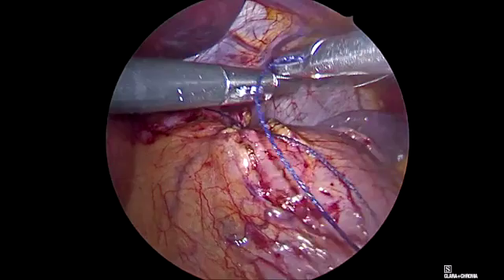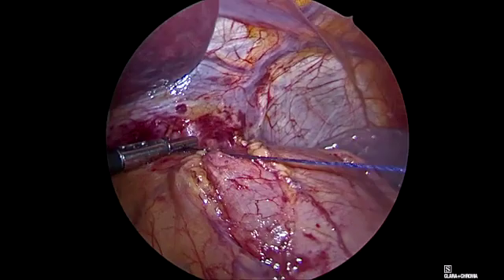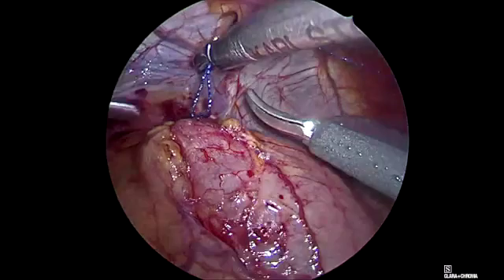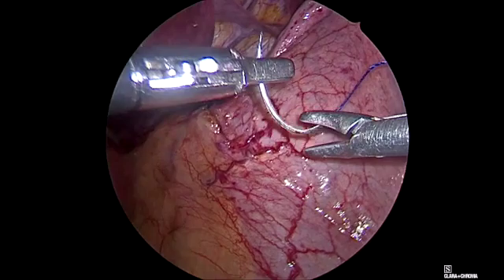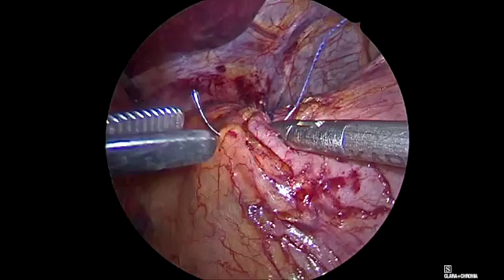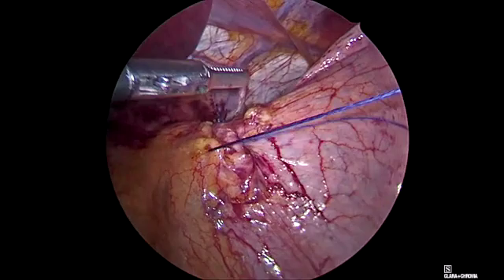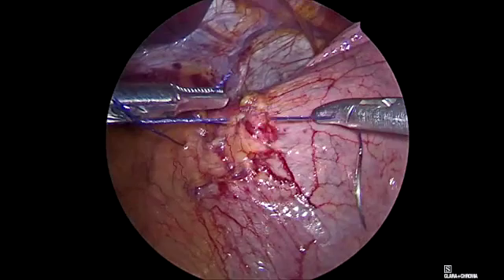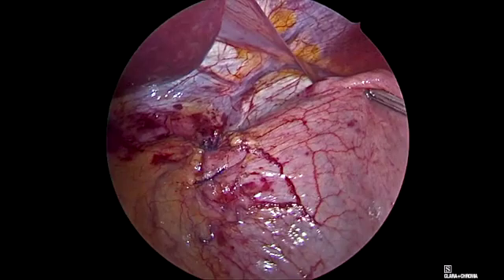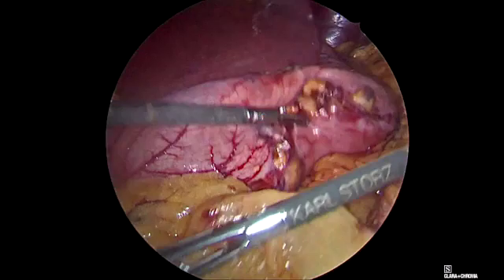Especially in young patients where the amount of intra-abdominal esophagus might be long, they might be mistaken about where the transition is and staple at the angle of His. Here comes the last stitch. Sometimes the sling fibers are practically visible — we see the thickness of these muscles around the cardia. So now our prophylactic cardioplicature is ready and we are going to release the bottom of the greater curvature.